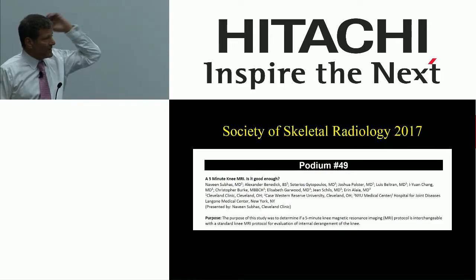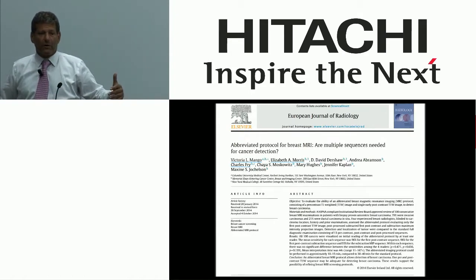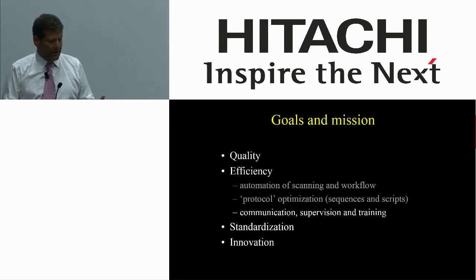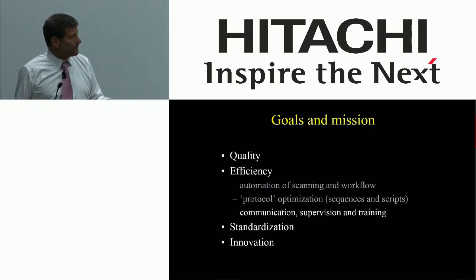Here's one on the knee, 5-minute knee. Turns out it's good enough, okay? What about breast imaging? Do we need to do that big elaborate breast protocol, or is there a more abbreviated breast protocol that seems to work? There's a couple of papers out there that point to the fact that breast imaging can be done with fewer phases, perhaps even without contrast.